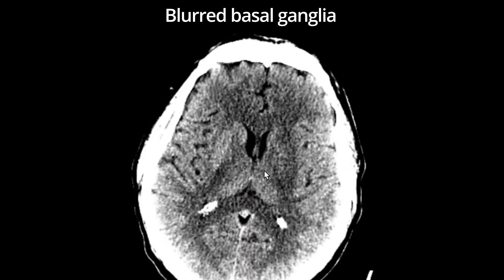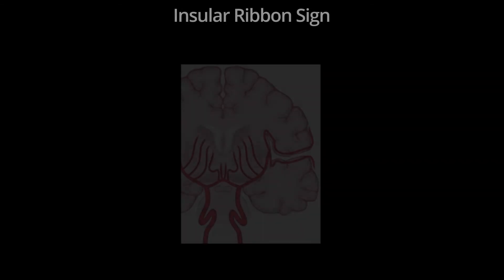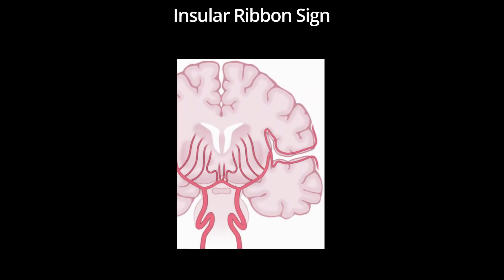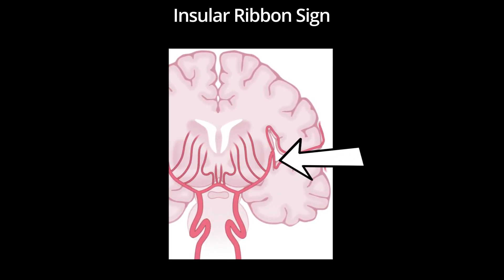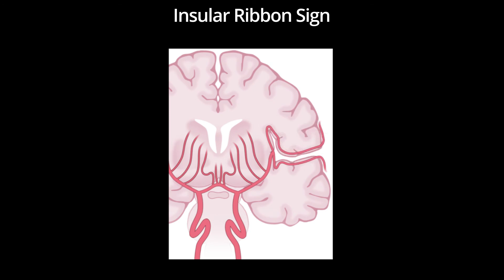Another early sign of MCA ischemia is the insular ribbon sign. The M2 segment of the MCA travels in the sylvian fissure, and is also known as the insular segment, because it supplies the insular cortex, as shown here. This segment of the MCA is most distal to both the ACA and PCA collaterals, and is therefore a watershed area, which is often affected by MCA territory ischemia.